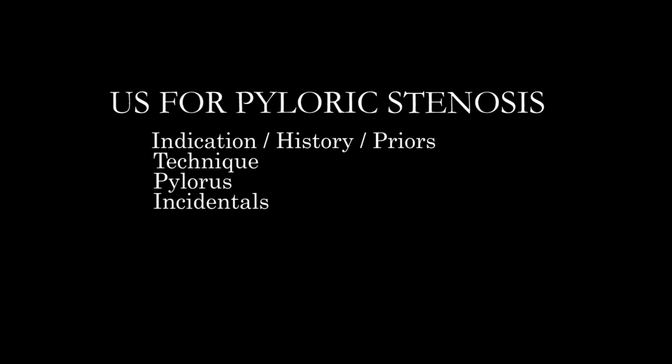And then once we get good images of the pylorus, we're going to be looking for single wall thickness. We're going to be looking for channel length. We're going to be looking for any potential movement of things through the channel in the pylorus. And then we're going to be making sure that we are looking for alternative explanations, whether it's mucosal thickening, whether it's other obstructive lesions, whether there's anything else that could be a potential explanation for the patient's presentation.